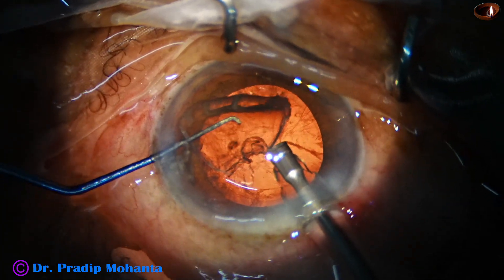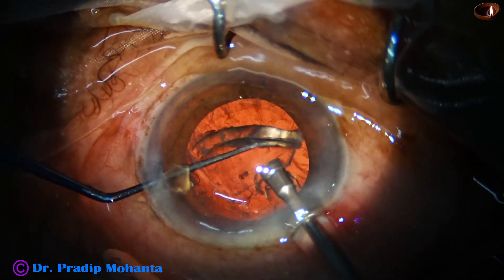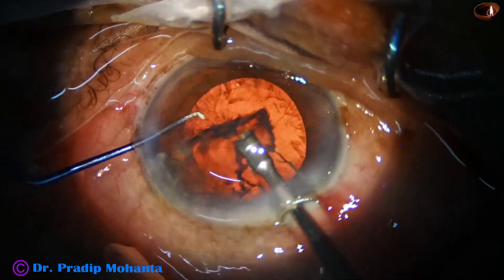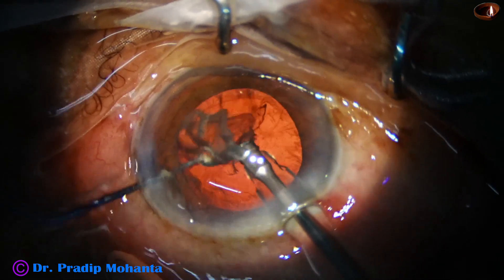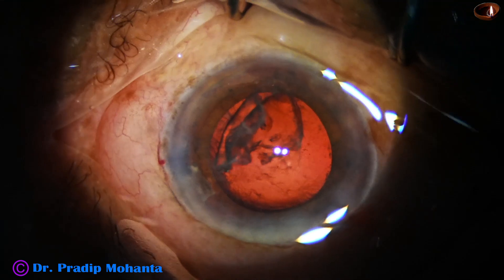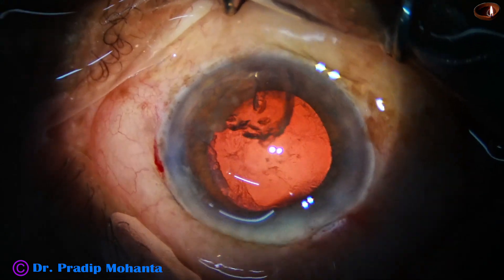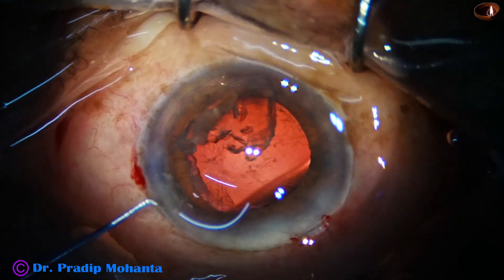At this time I am thinking whether to emulsify this epinucleus or not, and I find that the posterior capsule is very very close to the tip. Whenever your intuition says that it is going to be dangerous, stop. Find out what needs to be done to be on the safer side. Never cross the threshold of safety.